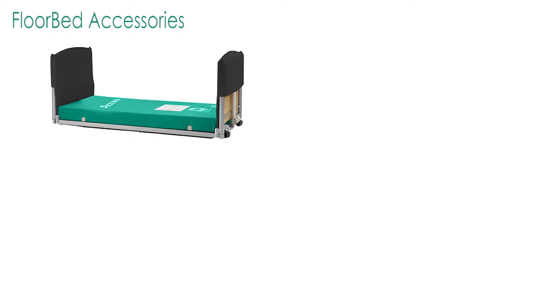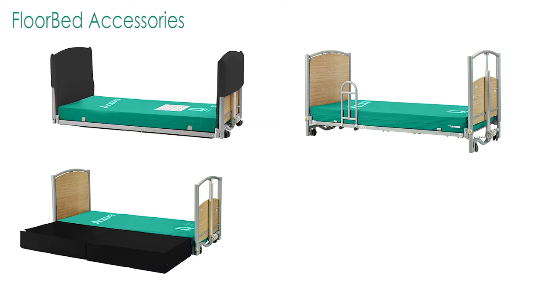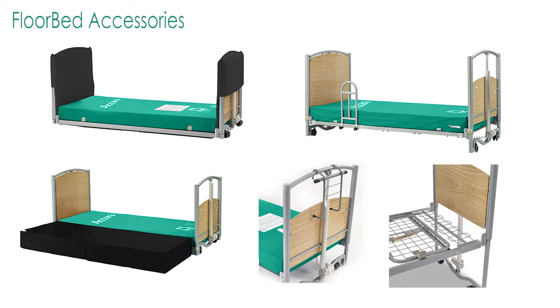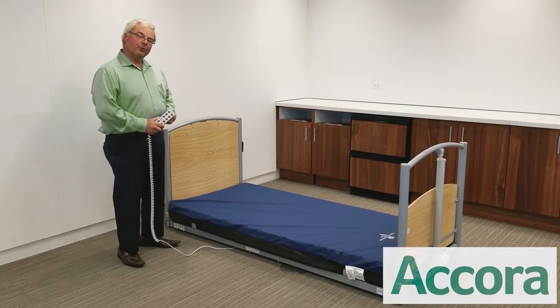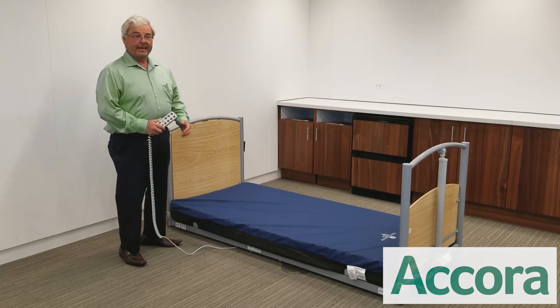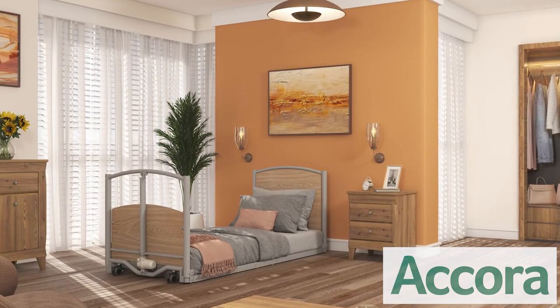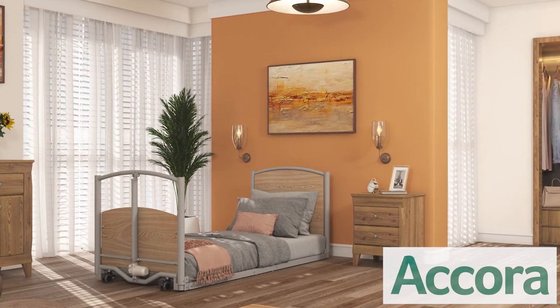Floor bed accessories include head and foot board padded bumpers, assist bar, a high safety mat, a pump holder, and mattress extension. In conclusion, the floor bed is a bed for all — floor level for fall risk patients, and it can be used like any standard nursing bed. The floor bed is fully compliant with the latest standards and has a high level of clinical functionality. Thank you.